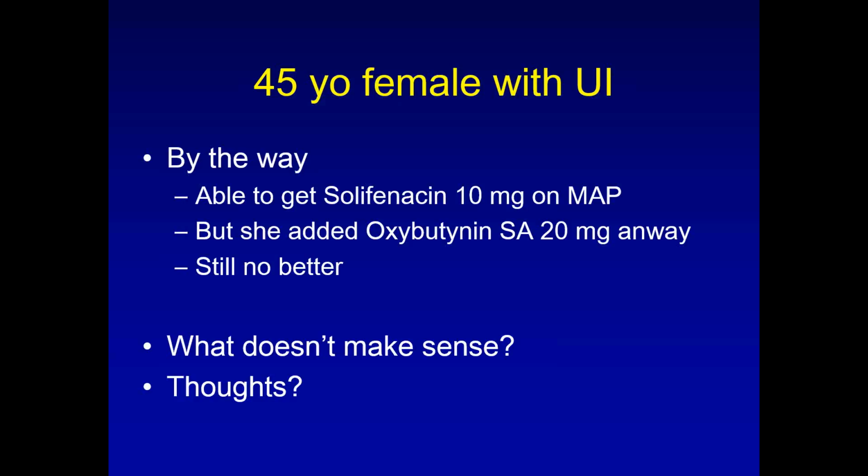What should everyone have before they go in for urodynamics? Oh, here's somebody. Vicky? Yes. What would you like? I was just trying to guess what it would possibly be. What did you guess? I typed in that the oxybutynin might have numbed the bladder even more. She's doing a lot of pushing and straining. Yeah, that's sure what happened. But I can't explain why she's going to the bathroom so much. That's why we were pushing the meds on her.